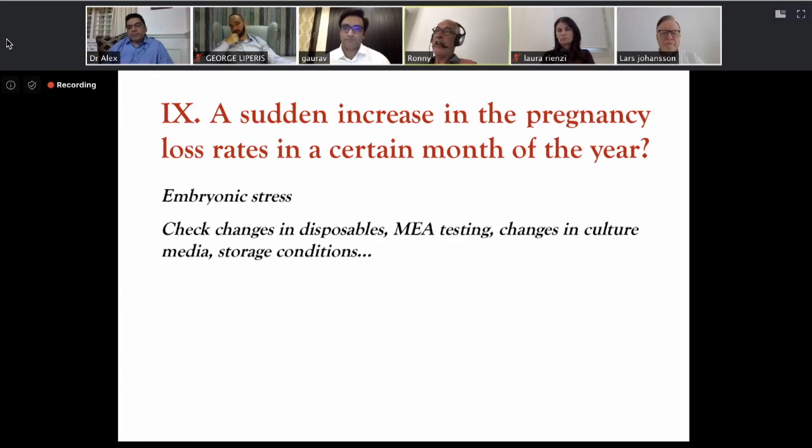Now, in this case, I find VOC a bad example. Of course, it can have an impact, but if you control properly, there are nowadays real-time monitoring systems to measure VOC, so you should be prevented when these spikes of VOCs happen. We know, and then you should close the lab for a while. Should not let it come that severe.